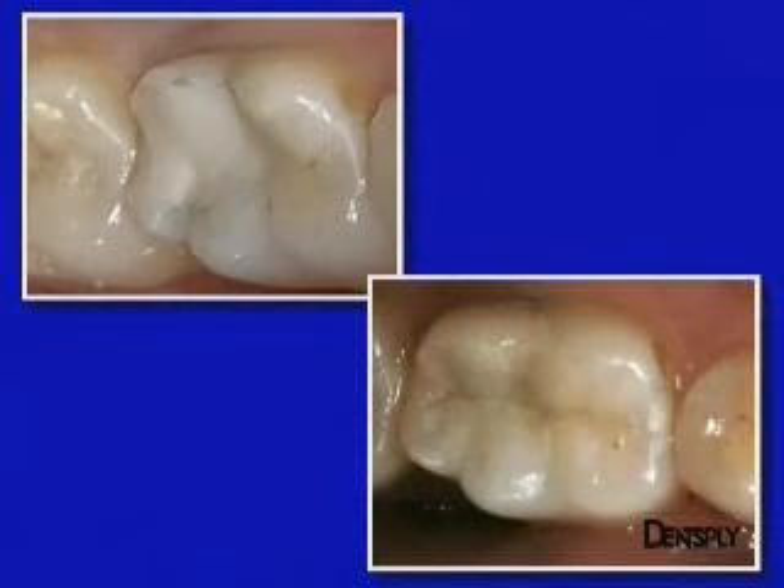A few weeks later, the good aesthetic and functional integration of this Ceramix Mono restoration — which it must be remembered was applied with a single shade — can be assessed. It yields completely satisfactory results.